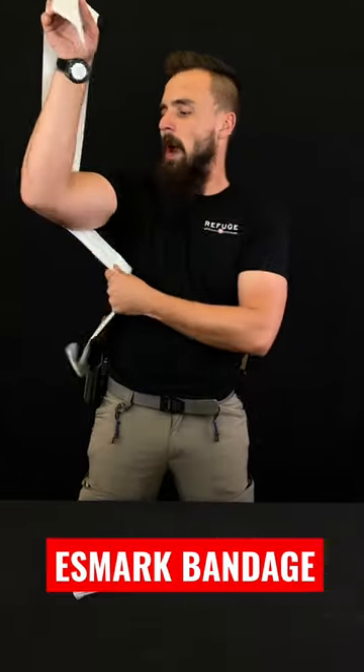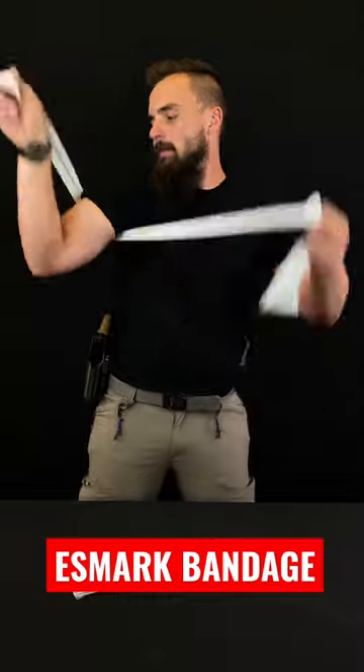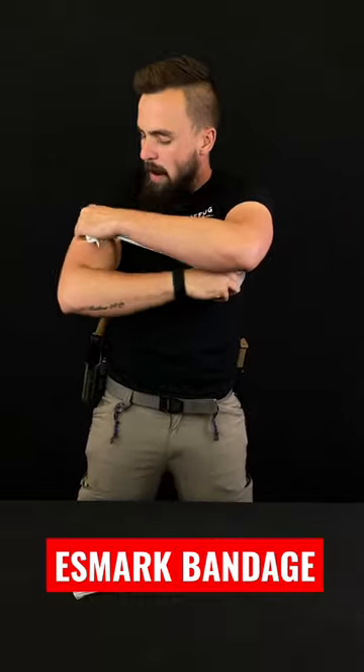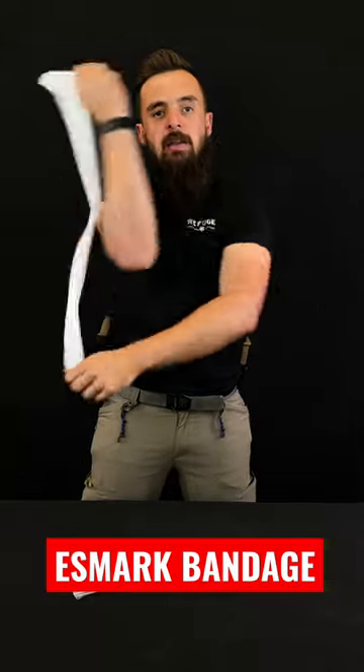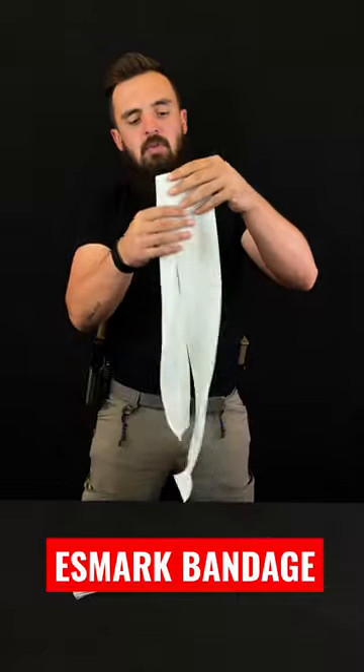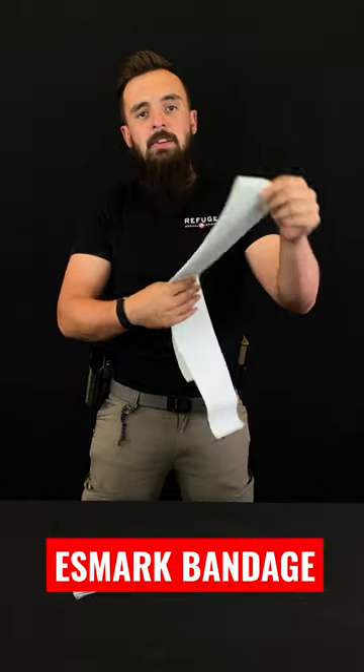And all you have to do is wrap the tourniquet high and tight and then create your two inches in diameter by wrapping it next to each other. With that, you then can just tie the tourniquet up really snug and move the casualty to a different location.